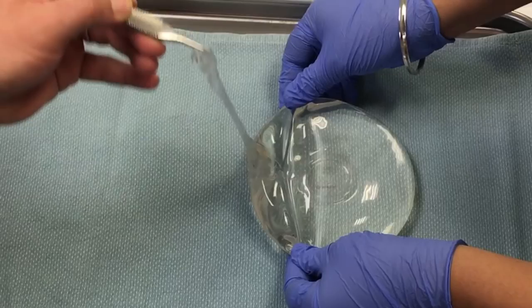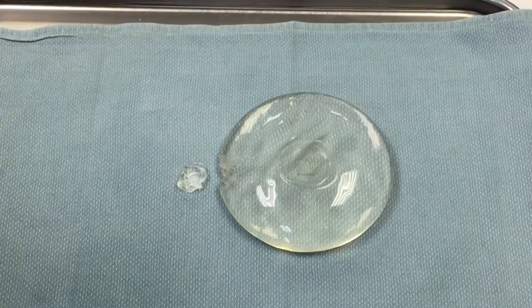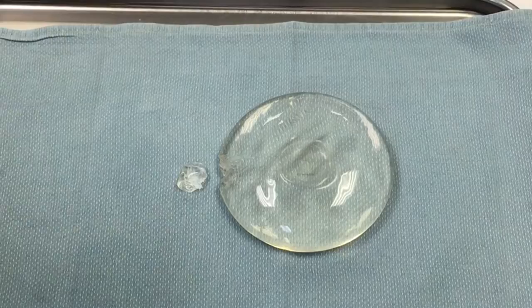This little piece of implant was cut out and pulls right out — it stays within the shell and no silicone leaks or pours out of the implant. This is a very highly cohesive gel, even for a standard modern fourth-generation silicone implant.